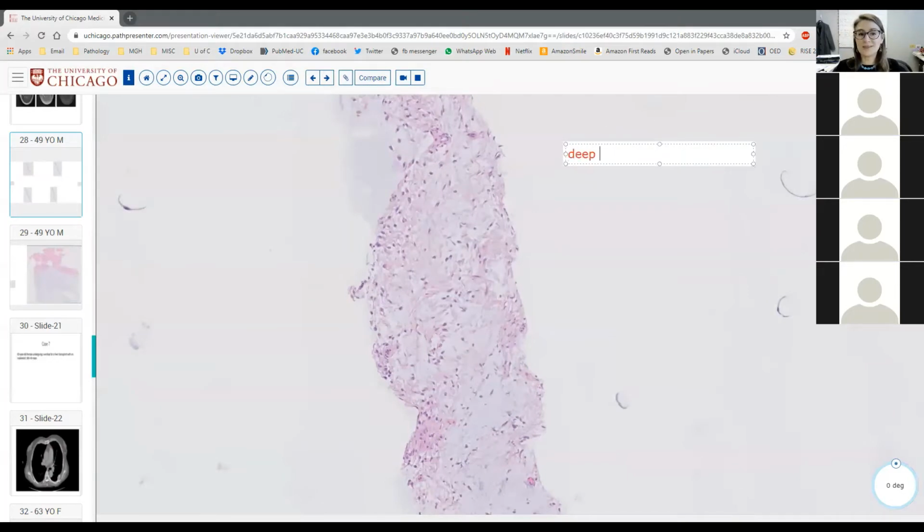So there are deep, aggressive angiomyxomas in the GYN or pelvic area that are highly infiltrative, richly vascular, have vessels of varying sizes, and often a hybrid collagenous to myxoid stroma, not really in the peripheral soft tissues, all right?